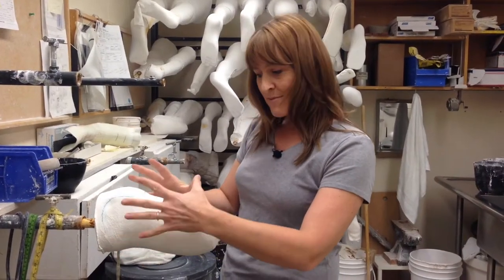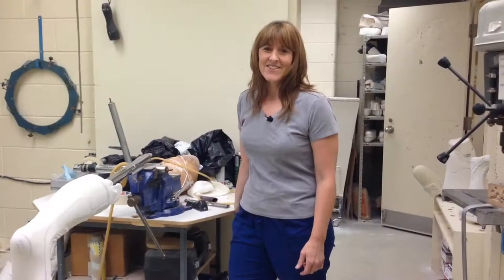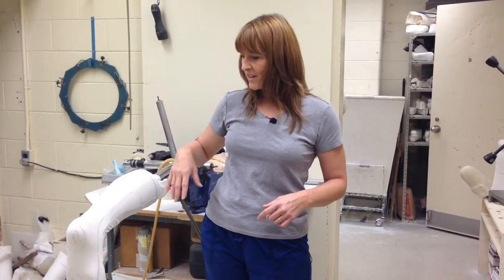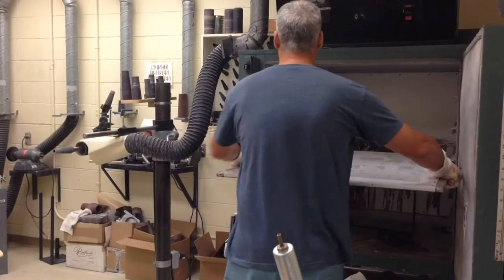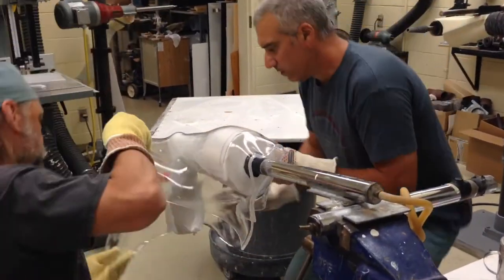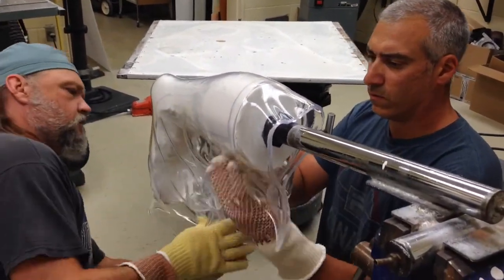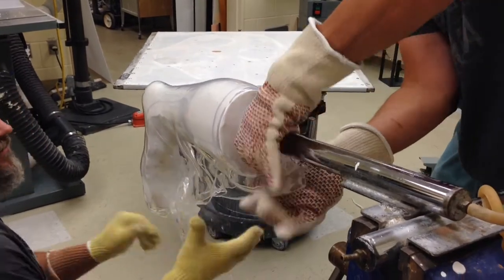Once this is ready to be made, we send it over into our next area of the shop. This is our machine room. Certified orthotist David will build his own limbs and then pull plastic over top of it under vacuum to achieve a shape that he sands down, polishes, and makes smooth, getting it ready for fitting with the patient.